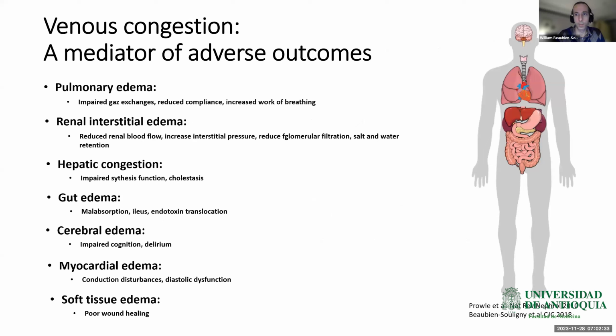For example, for the venous Doppler, you can calculate the proportion of the cardiac cycle in which you see the venous signal, which is commonly called in the literature the renal venous stasis index. And of course, as venous congestion develops, this proportion of the cardiac cycle where we will be able to see venous flow coming out of the kidney will be further and further reduced.